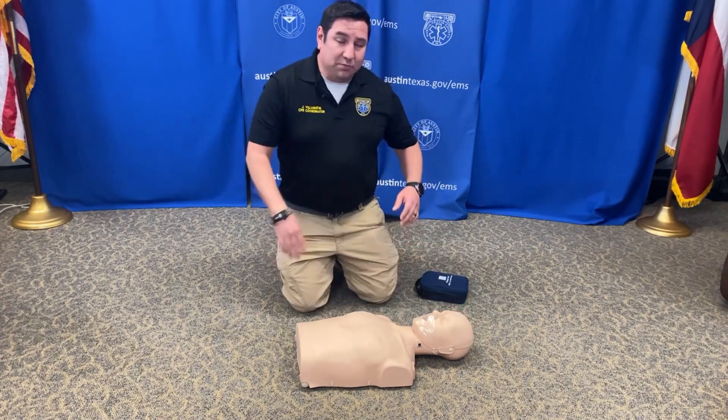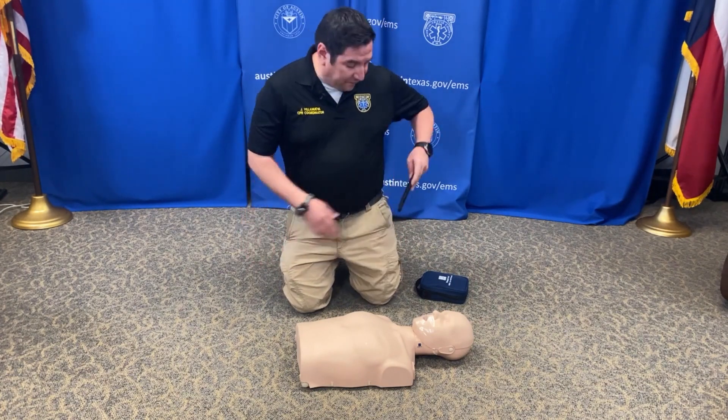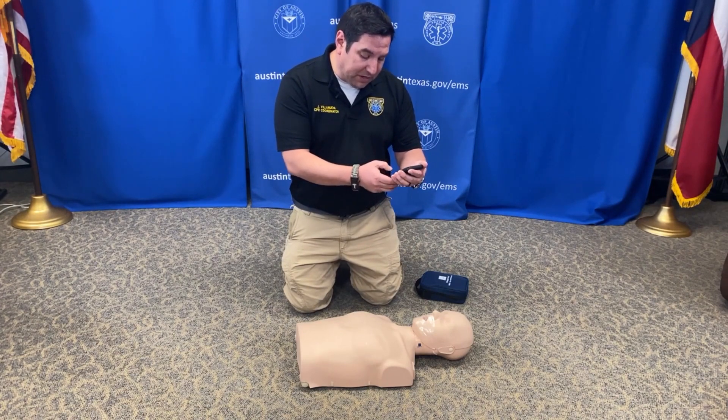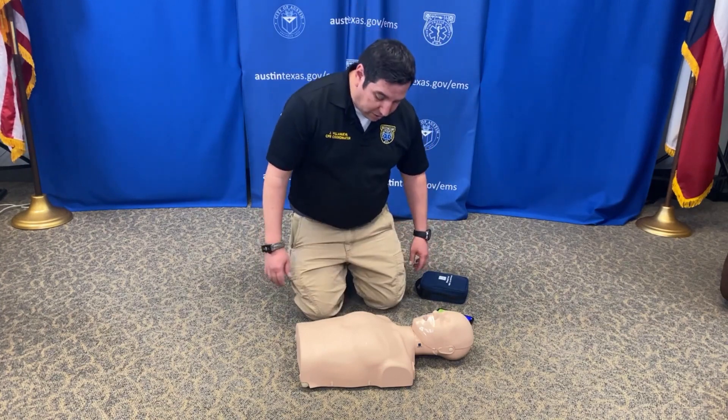They're not breathing. At this point, yell for help: 'Help, help, help!' If help doesn't come and you're by yourself, take out your cell phone, turn it on, put it on speaker, call 911, and start talking to our dispatchers. Let them know that you're alone.